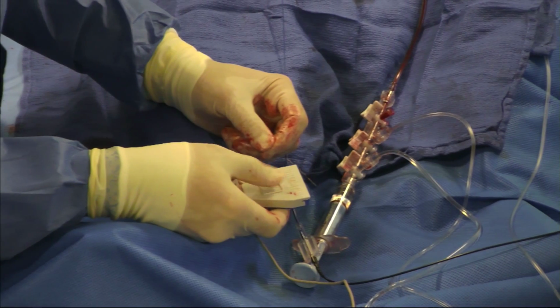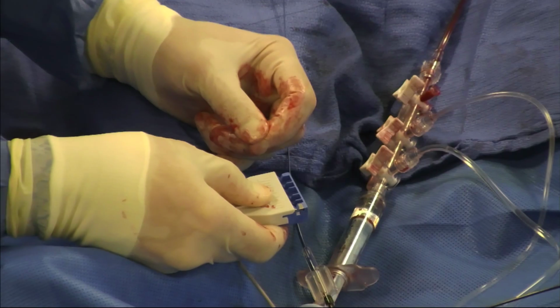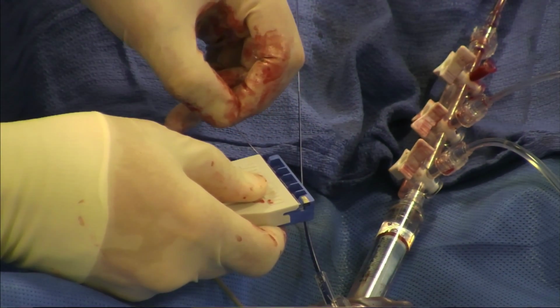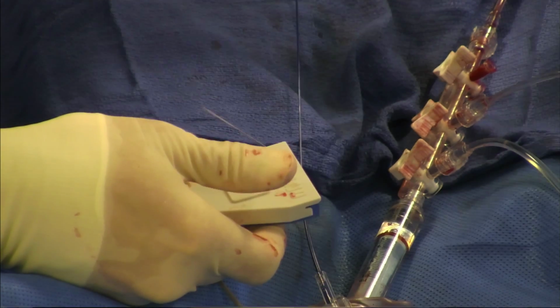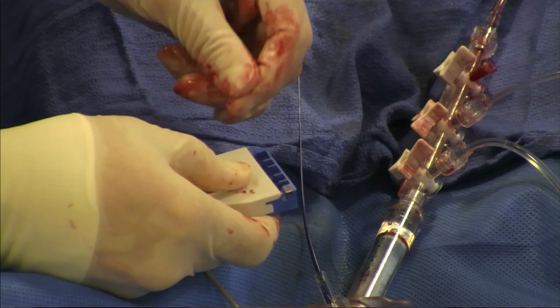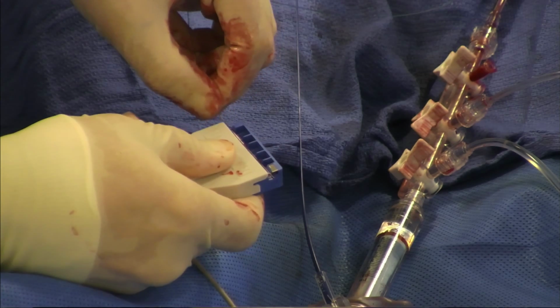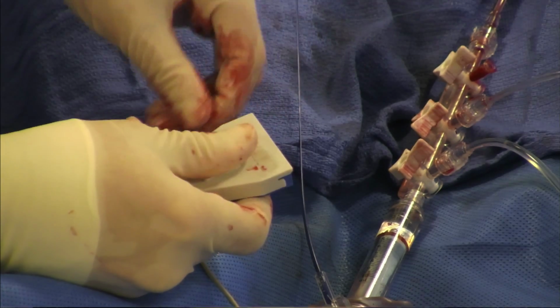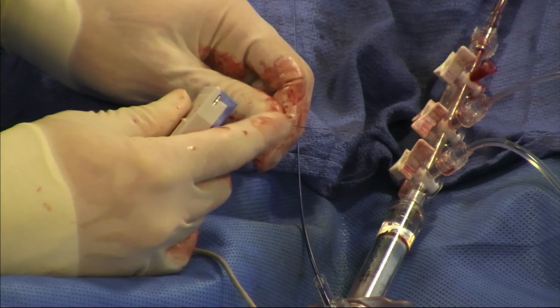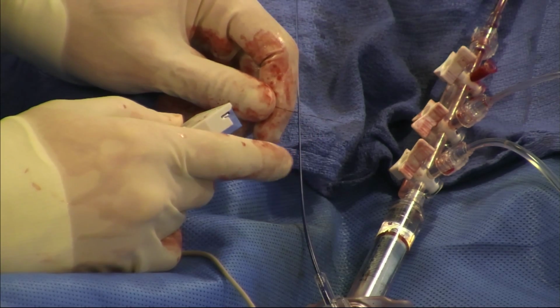So remember, in the packet it came like that and the wire was attached. I can slide the wire that I've just removed back in. There's a little catch as it gets to the end, and that's it. We're ready to use the wire again, and if we want to detach, which is what I did to get the IFR catheter in, it's there. So attach, and detach. Again, the contacts were very difficult before, but this is very easy. It's got 3 or 4 contacts on there, so we always get a good signal out of it.